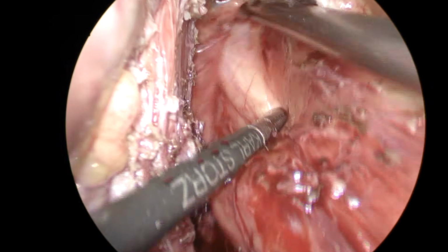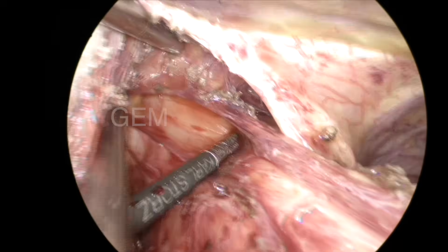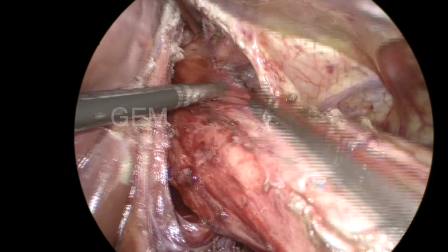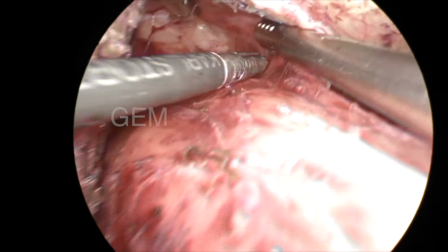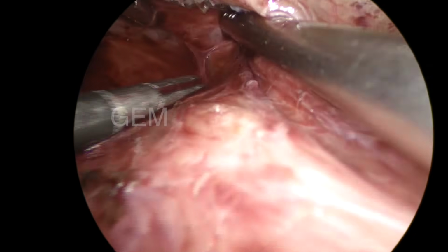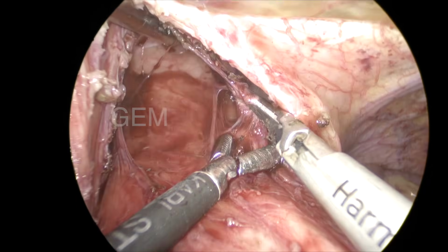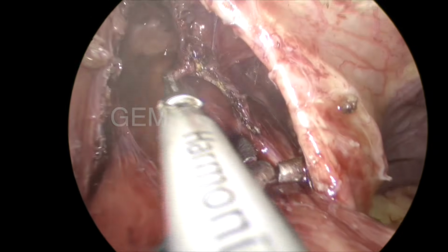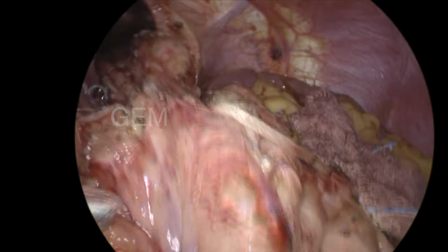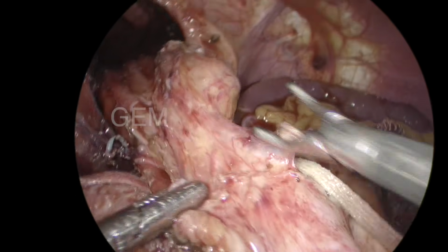Now, you can see the pleura is going away from the esophagus. So, now you can see it is straight. So, it is done anteriorly and on the right lateral side, and the left side is already done by excising the sac. It is a dilated esophagus, there is no doubt in that. So, now I am coming for myotomy.